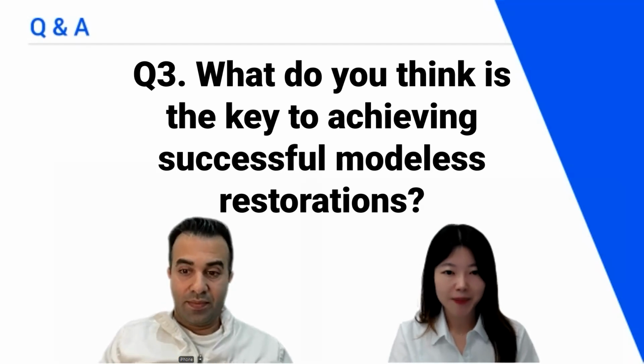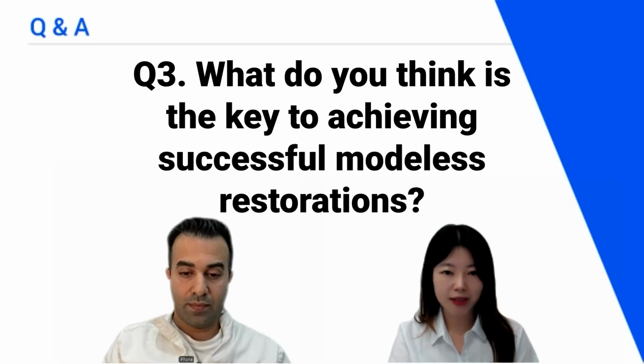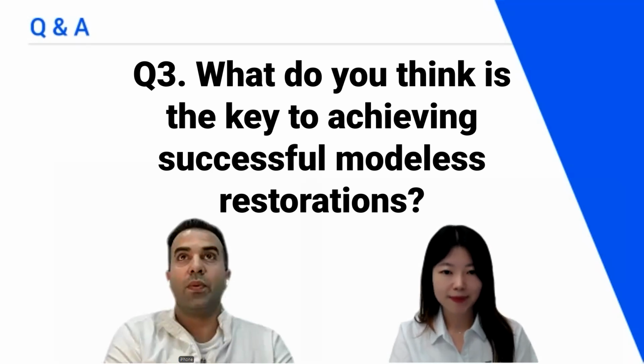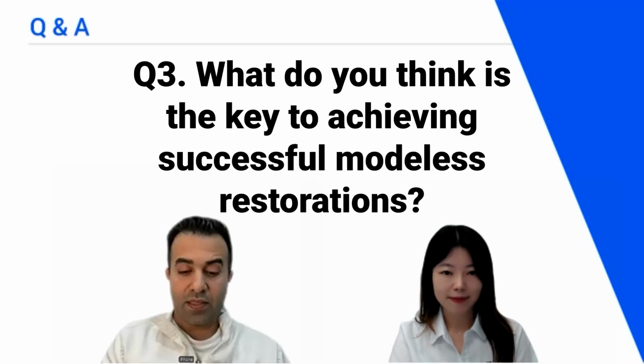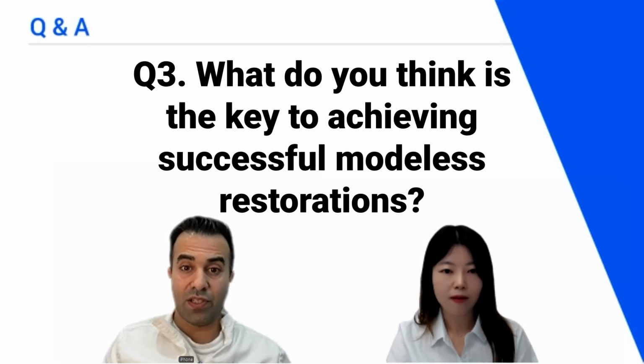Question number 3. Do you perform modelless crown restorations? What do you think is the key to achieving successful modelless restorations? Well, it is a personal preference. Myself, I haven't been doing modelless yet. However, in the future, I might change.